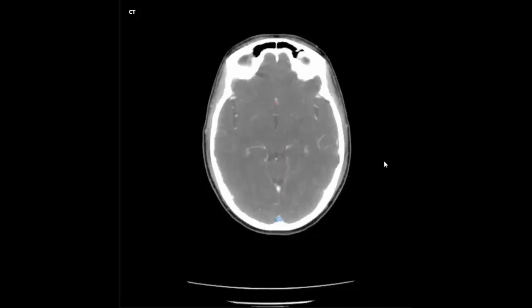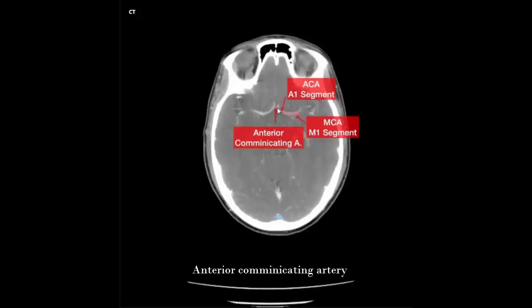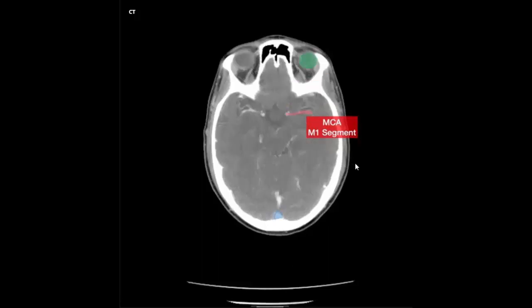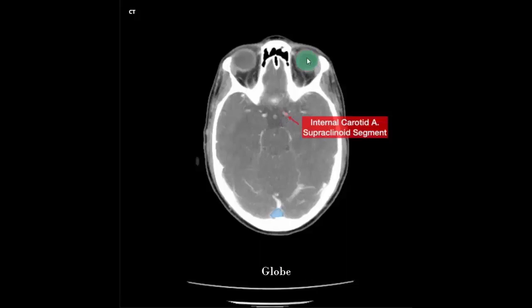Anterior communicating artery. Superior sagittal sinus, anterior communicating artery, right and left middle cerebral artery. Middle cerebral artery, right and left globe. Right and left internal carotid artery, basilar artery, right and left globe.